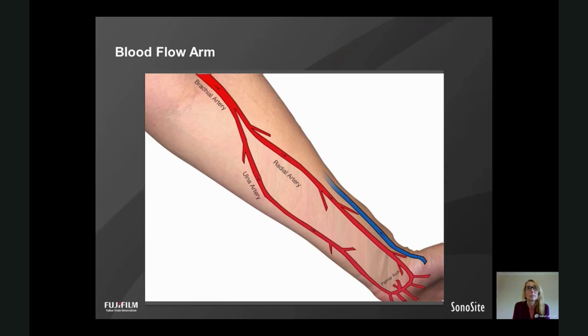So the heart has a big open area, it's a low resistance, and then as it pushes the blood towards the smaller and smaller capillaries, they create more resistance, and so the blood flow from the heart to the hand will travel in a pulse wave, and it isn't particularly high flow when we compare it to once an arteriovenous fistula is created. You're looking more in the low hundreds or even below 100 mils per minute in an adult arm.